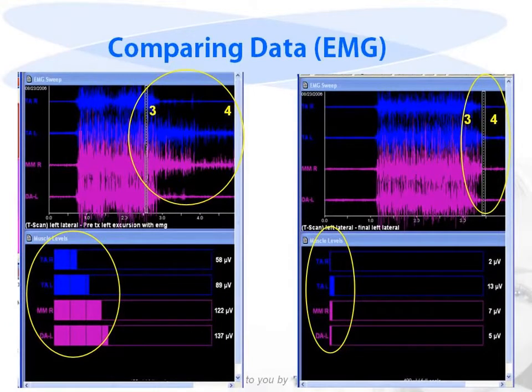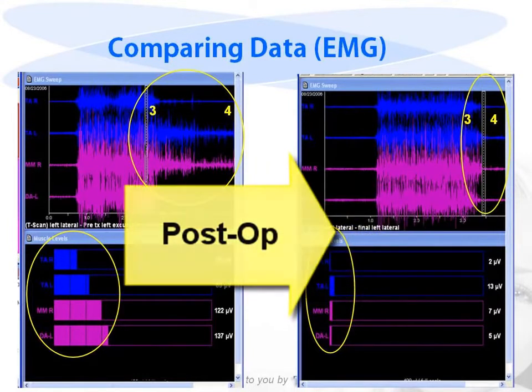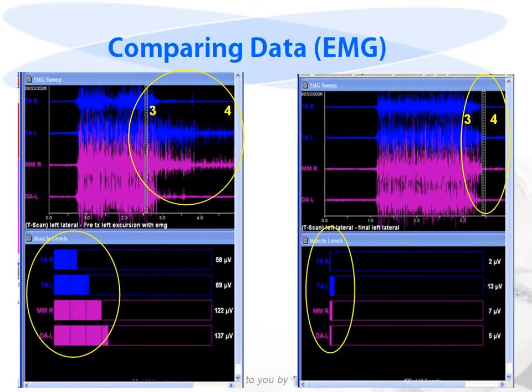In a comparison of the pre-op to the post-op condition, with long disclusion time preoperatively versus short disclusion time postoperatively, you can see the dramatic difference between the time it took to go from the commencement of the excursive movement, number 3, to anterior guidance, number 4. The muscle shut down almost immediately after reducing the disclusion time with occlusal adjustment. This clinical example shows what result the treatment has on hyperactive muscles during excursive function.